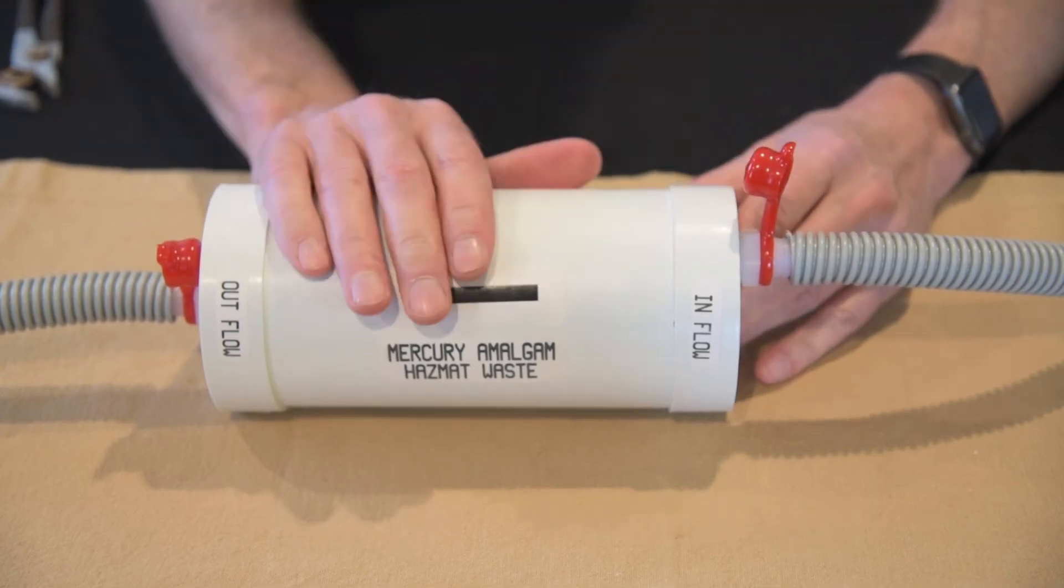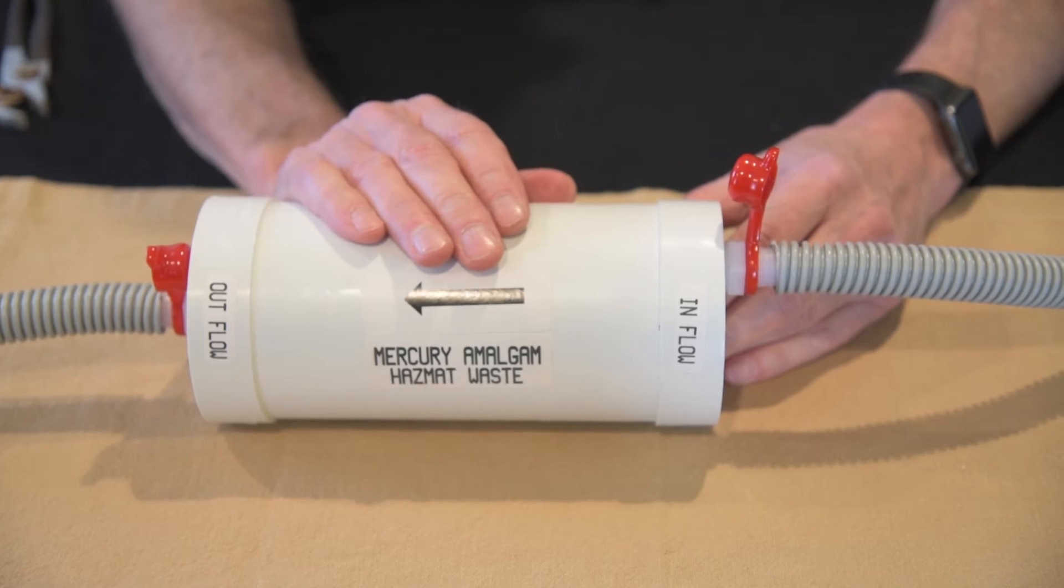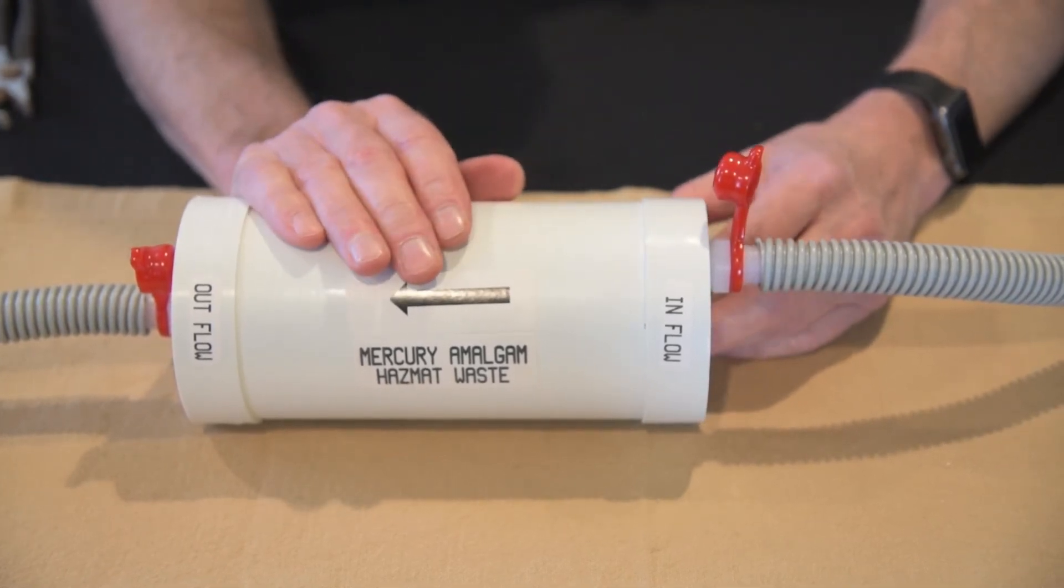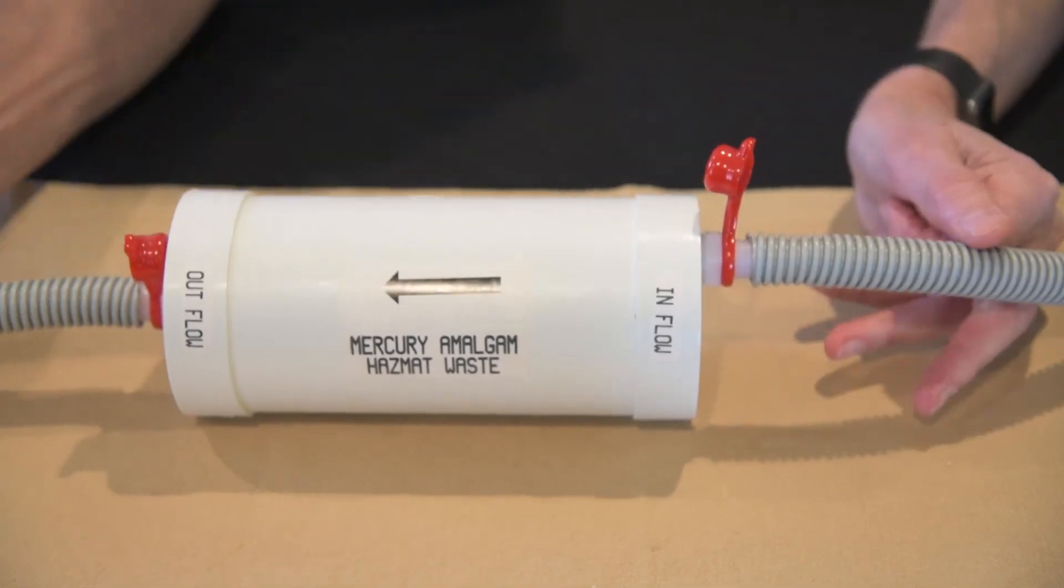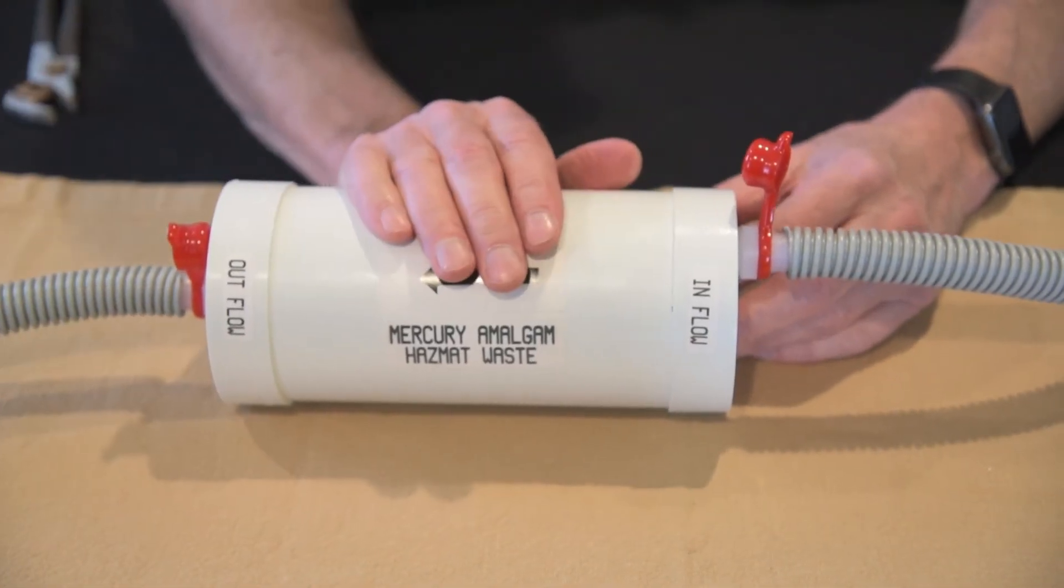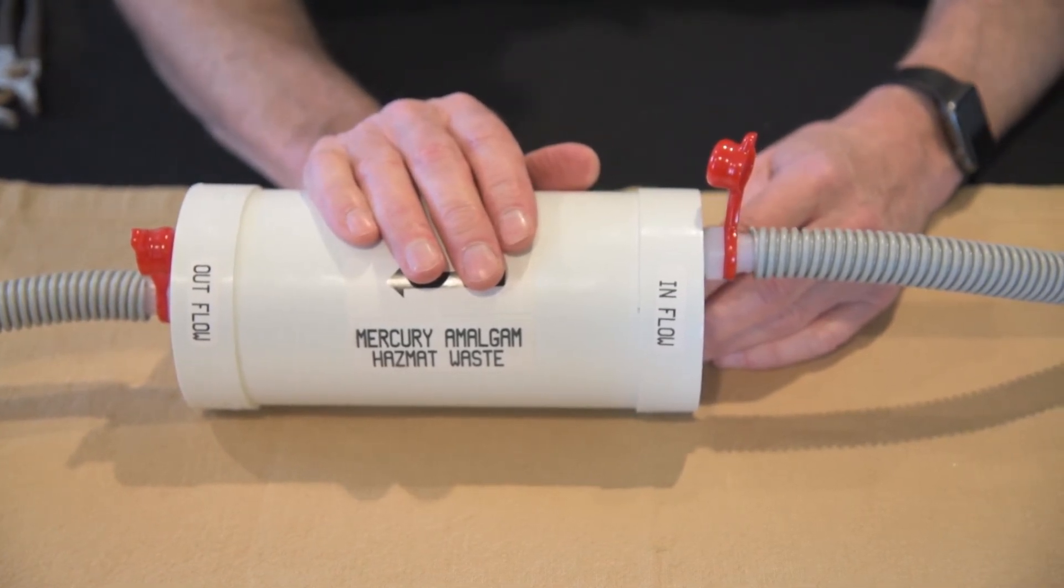Now if you notice that after six months or so, maybe you'll notice a decrease in your vacuum power. What should you check? Well, first of all, you want to check to make sure all your tubing is not clogged. Mine certainly gets clogged here. And that's an easy fix.